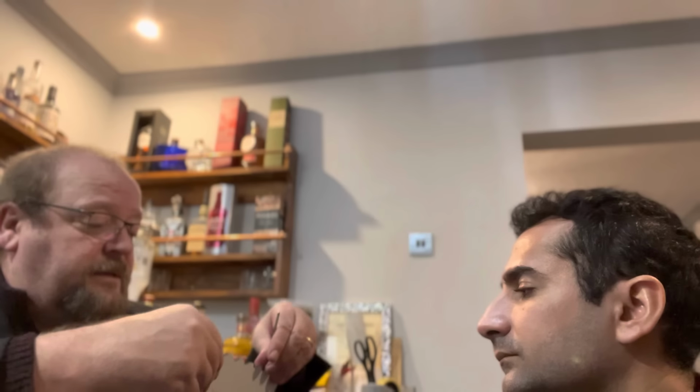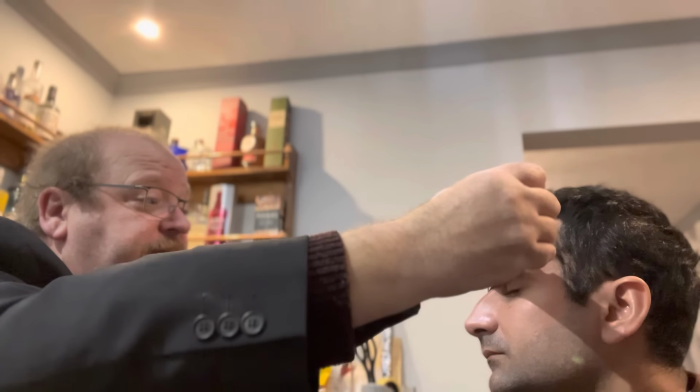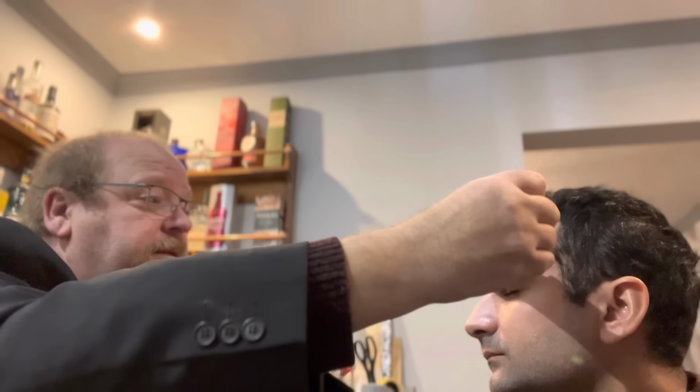And what we're doing now is we're using this, the metal part on here. I'm going to put the nought against your head. And if I do the right first, I'll put the nought on your nose. And what I'm after now, just bring this round until it just touches your nose. That should be pretty good. And that measures at 20 degrees. So that's the right side of the nose.